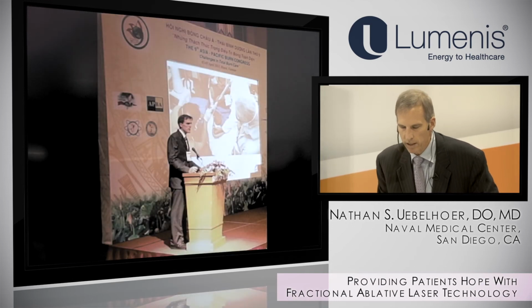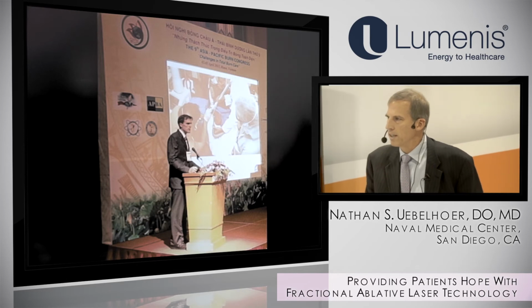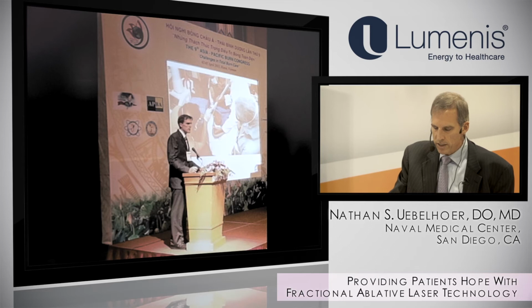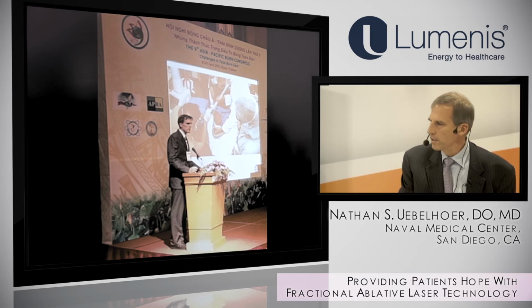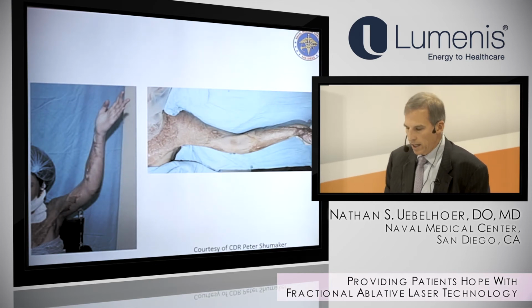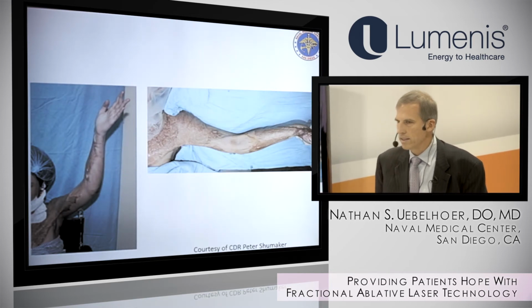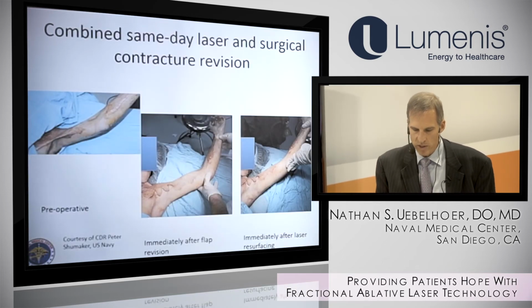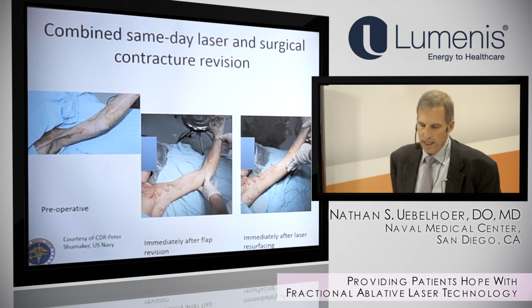And here's Dr. Shoemaker, who's my partner at the Navy. Now he runs the dermatology department there. He's done a lot of this work, and he was in Vietnam the following year, treating more of these patients. He treated this lady with both Z-plasties and the laser treatment all in one treatment day, and was able to get dramatic improvement in that scar as well.